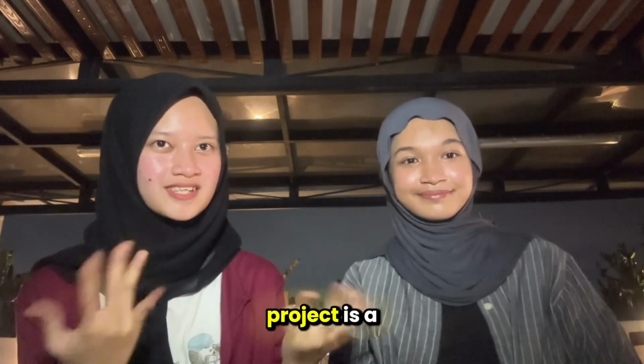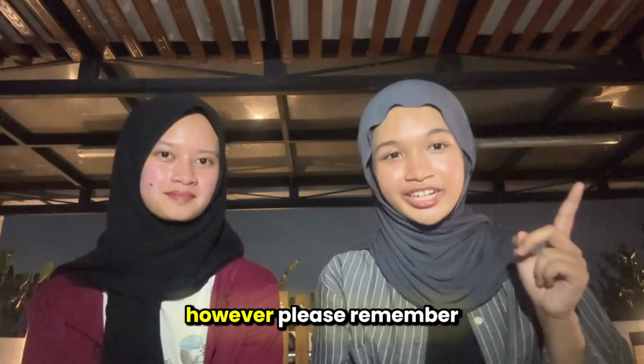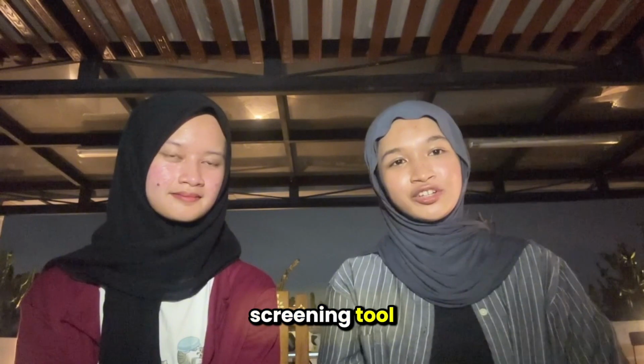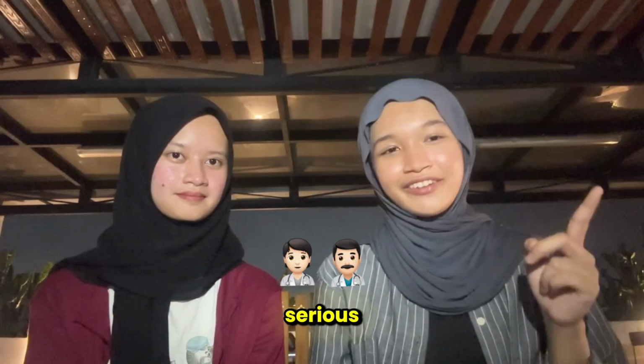The BurnScreen project is a real-world example of the collaboration between AI and healthcare for web development. However, please remember that this website is intended as an initial screening tool and not a definitive diagnosis. Always consult a doctor first if the injury is serious.